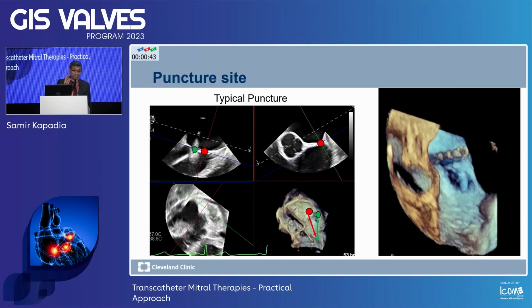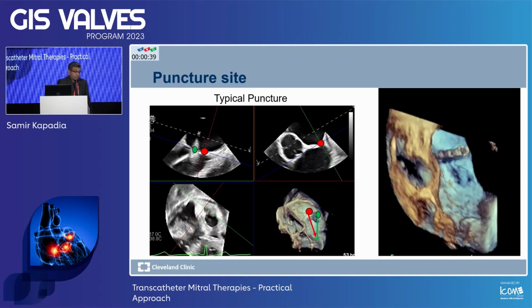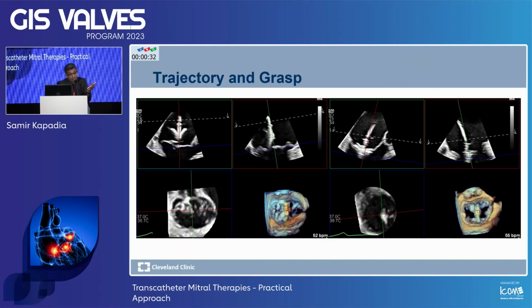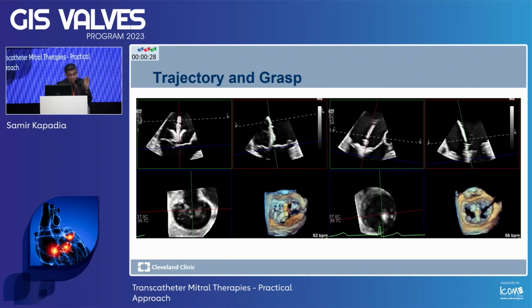Again, imaging is a very important part of this procedure, so you have to have a very good imager. As you saw in the aortic valve, everything you can do, I many times write in the note that if you guys see the mitral valve or tricuspid valve, we'll be able to treat it. So the same thing is true, you have to have good imaging.